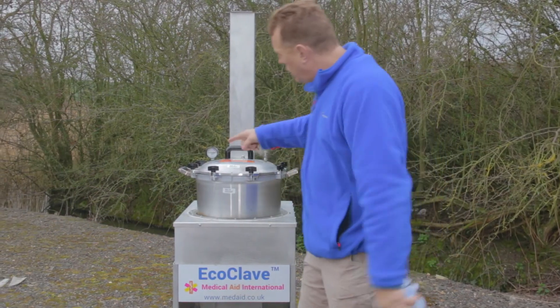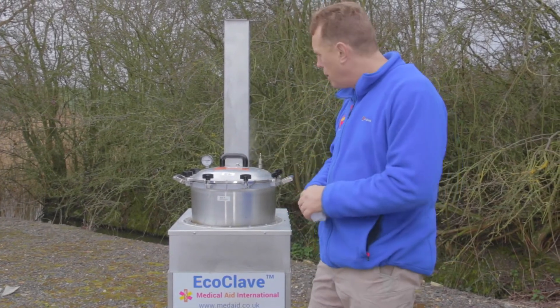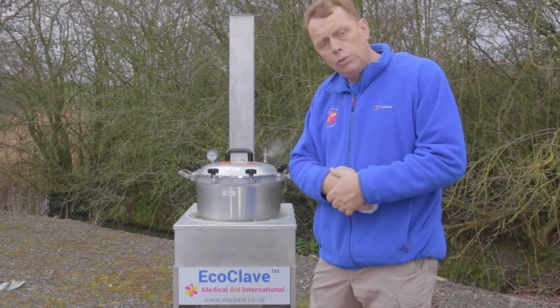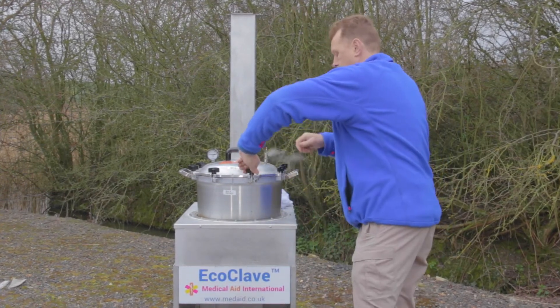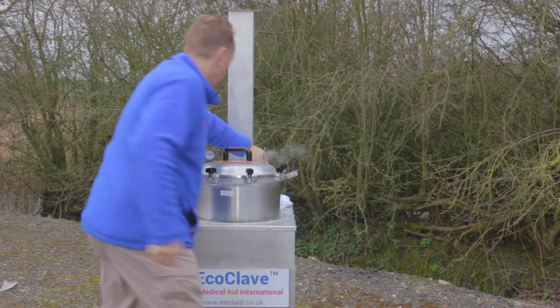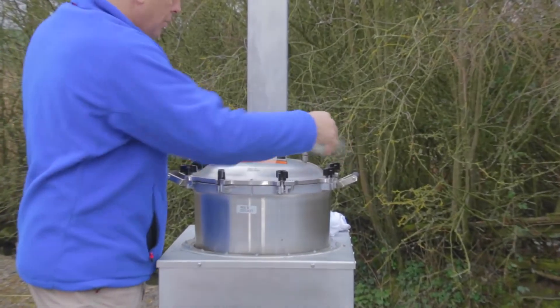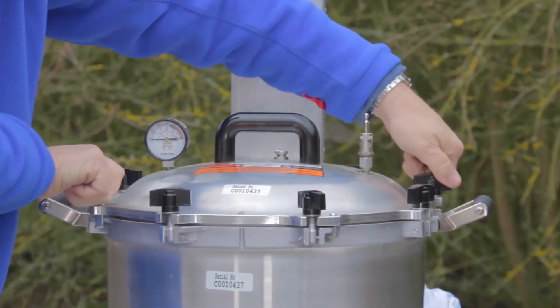The pressure gauge is now at zero. There is some residual steam coming out since the water has been boiling inside. Once the pressure gauge is at zero we can release all of the bolts holding the top of the autoclave down. We release them at opposite ends of each other — the same way we tighten them at the beginning, tightening opposite sides simultaneously — and we do the same when releasing them.